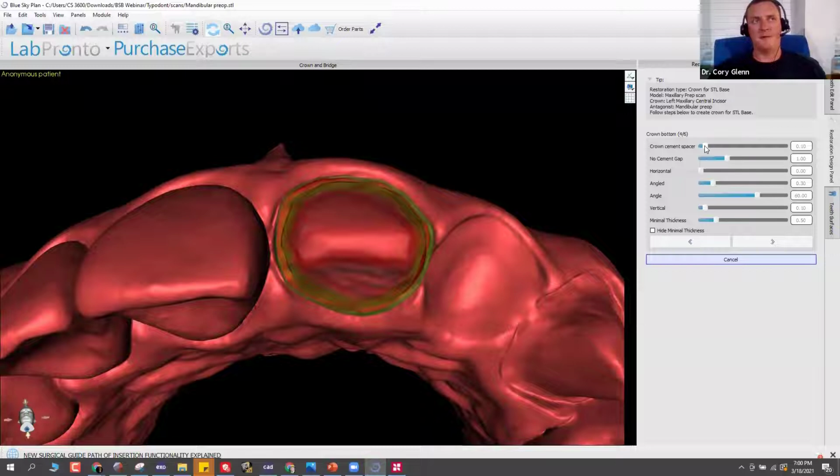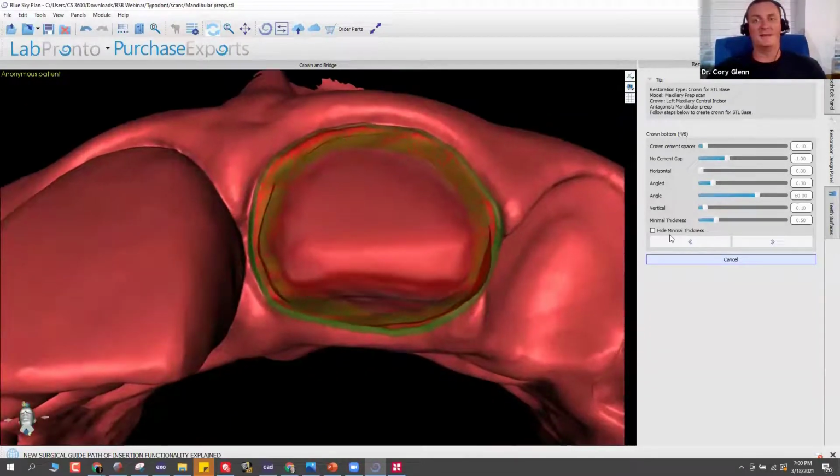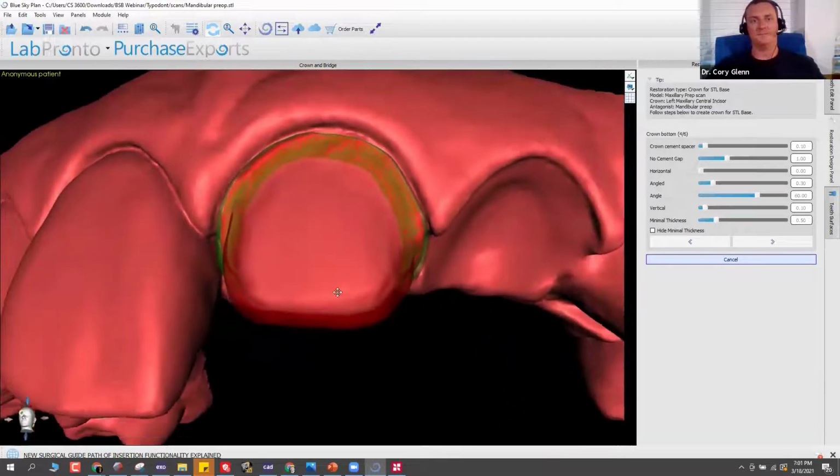And again, it's an off-label use, but none of them have broken to this point, which, you know, prior to this permanent resin, I had tried that. I can't tell you how many times, and they universally all broke. The printing resin was just too brittle. These new ones have not. So that's as much as I can tell you, but it's insanely strong. I would have zero problem doing it with full arch provisionals.